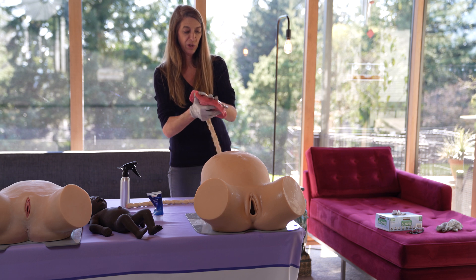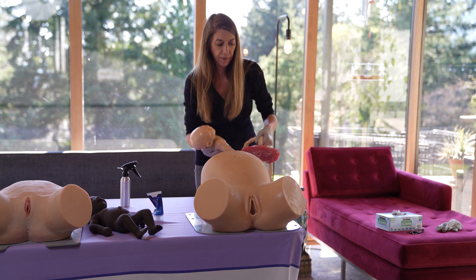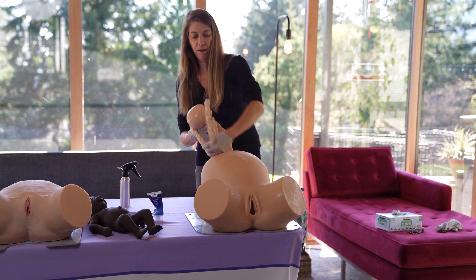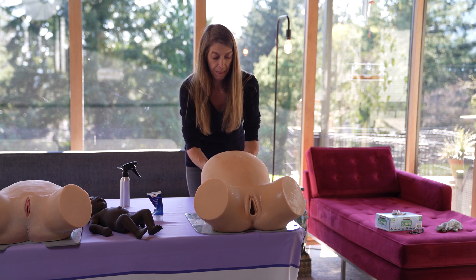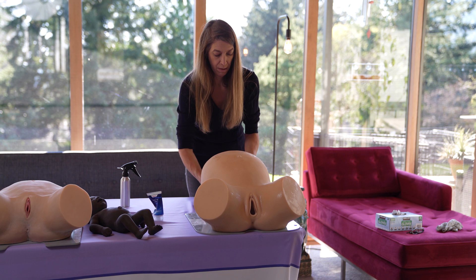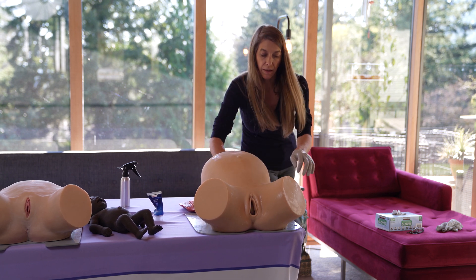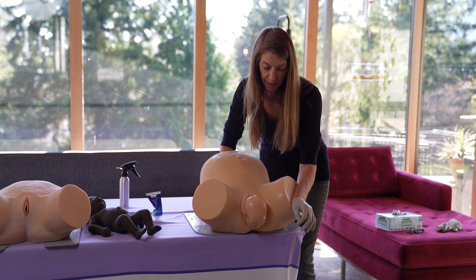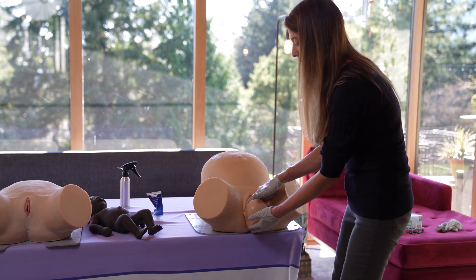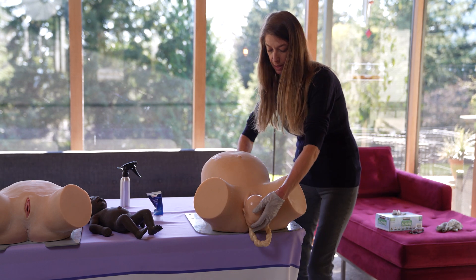You can also use accessories that come with Sophie. This is her placenta — with just a little lube on that, I can simulate a nuchal cord and deliver the baby with the cord around her neck. Doing it the same way as the regular delivery, and then when the student goes to assess for the cord, there is indeed a cord which we then pull up over the occiput. And now baby's ready to deliver.